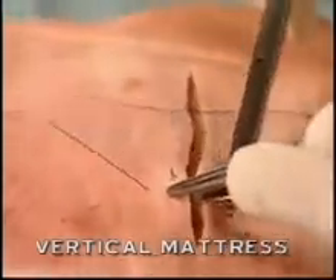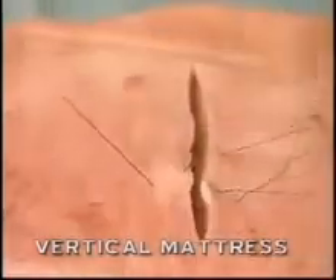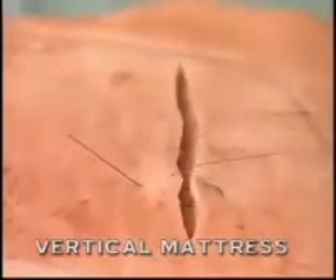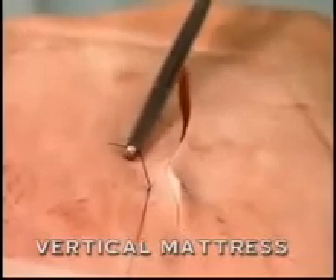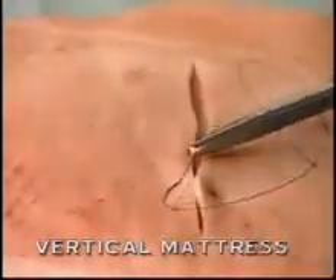This is the far-far component of the vertical mattress suture. The near-near component will be vertically oriented to the far-far component. This portion of the vertical mattress suture goes very close to the skin edges, taking as little of the skin as possible.